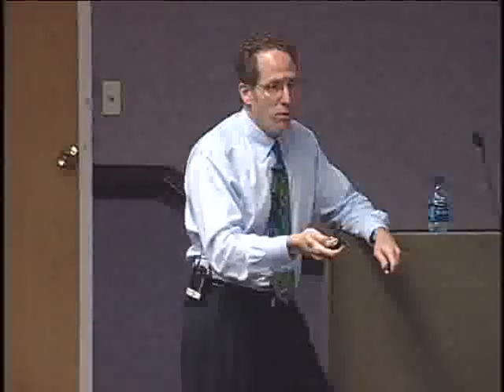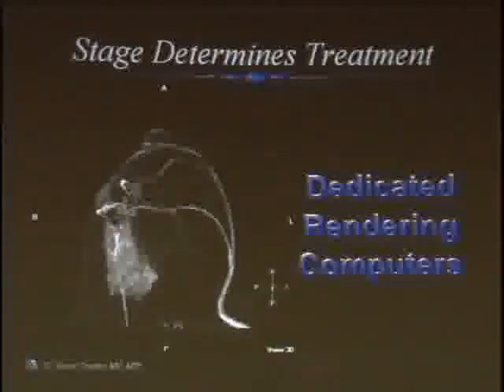Not everybody does this. Some people just scan the breast and give you a report, and there's none of this appreciation in 3D space. So again, order the breast MRI from the people who are your experts. Go find out how they do it and get the right one for your patient.